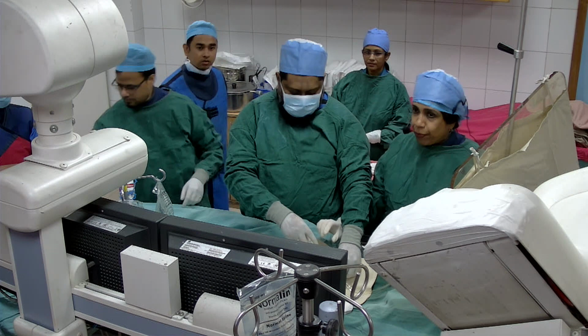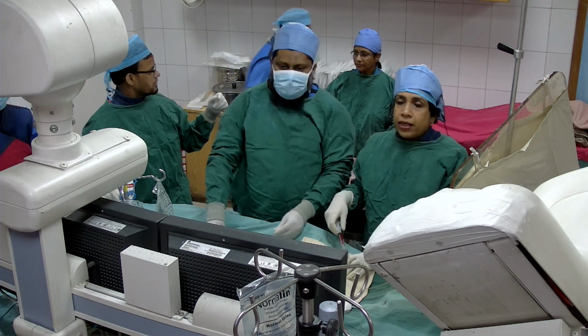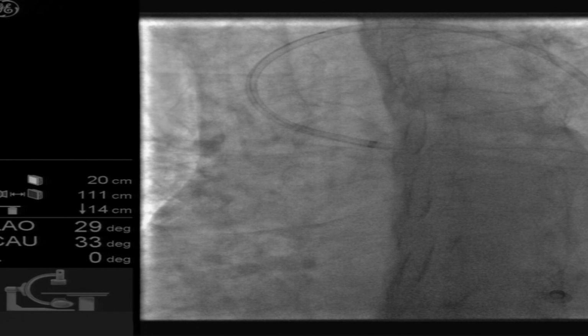So we didn't take any pictures, right? I thought we would be showing the angiograph. Anyway, let's take some pictures and we have the pictures, right? We have the pictures. Or we can take.